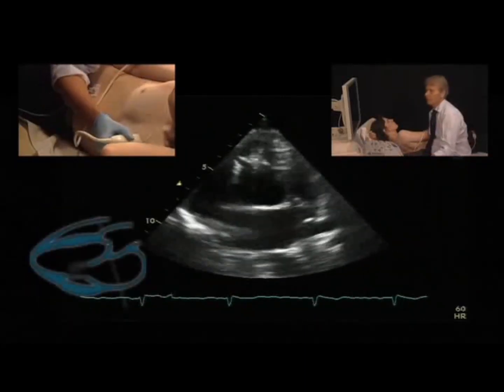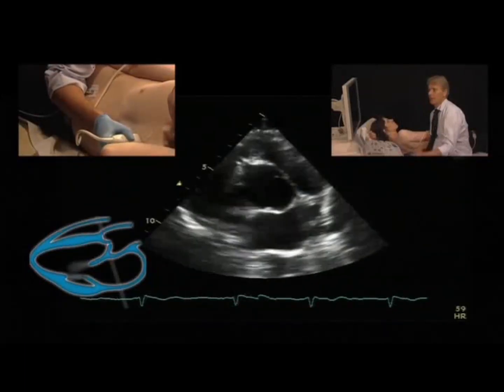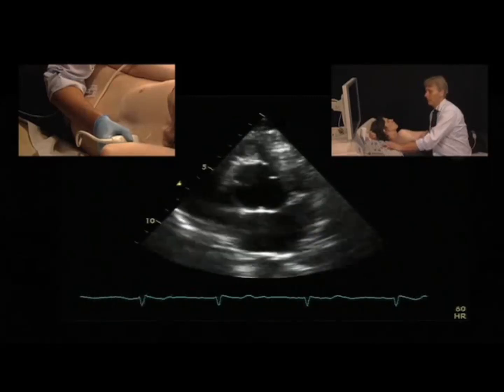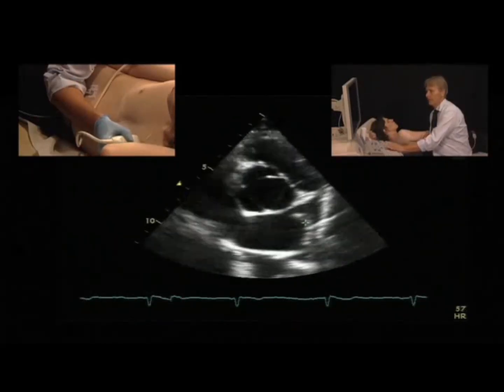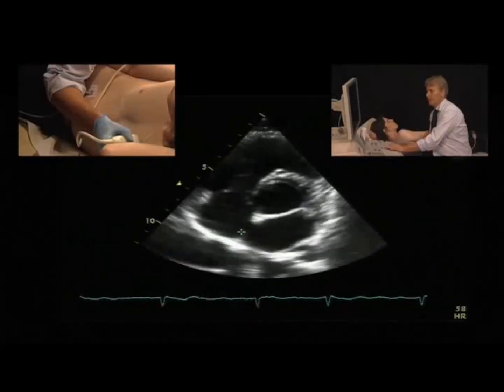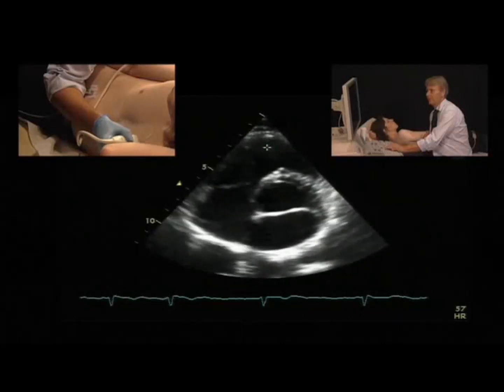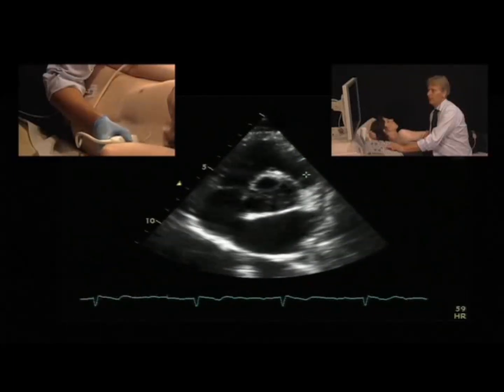We can cut the short axis at different levels. At the level of the base of the heart, we can see the aortic valve, the left atrium with the left atrial appendage, the interatrial septum, the right atrium, the tricuspid valve, the right ventricle, the right ventricular outflow tract, and the pulmonic valve.